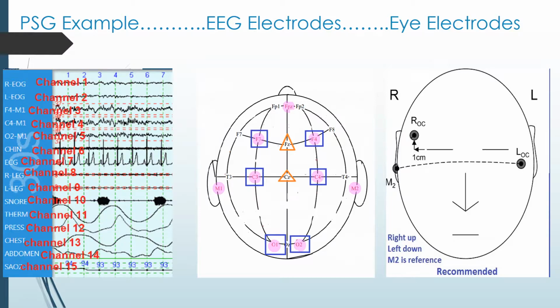Back on the old paper machines, we didn't need a system reference because we could only capture the data that was actually being recorded on our paper machine at the time. So computerized systems allow us to gather data from all the electrode sites because of this system reference electrode, or FZ, which paper systems didn't have. Okay, one other thing, our CZ electrode, also in a yellow triangle, is our ground electrode, and that's your electrical safety ground. Let's go on to our next slide.